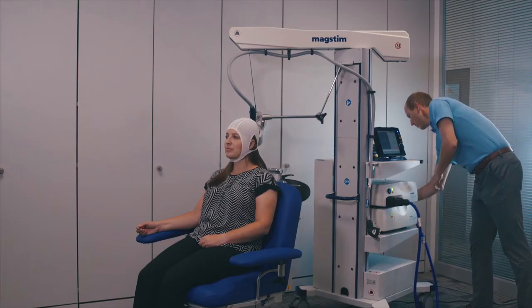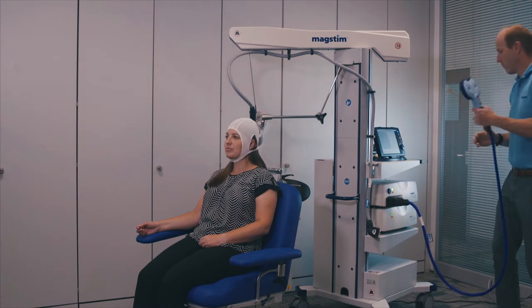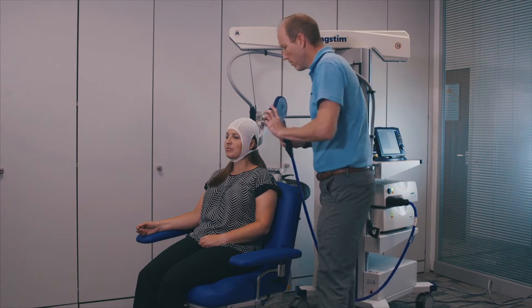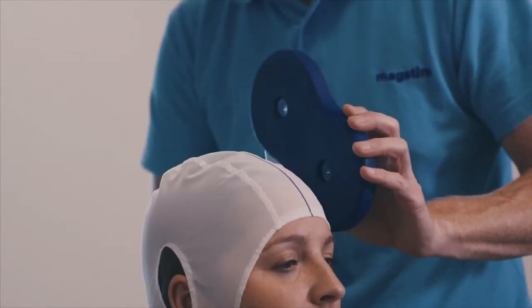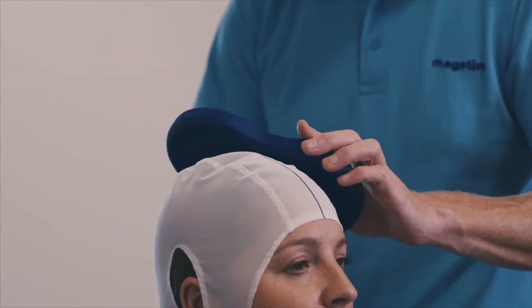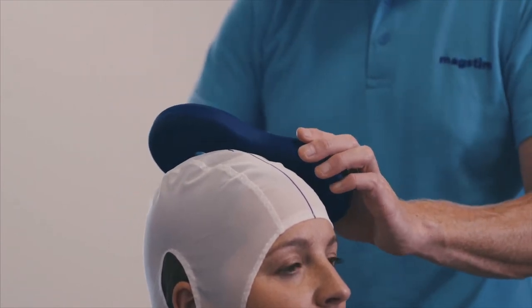Take the Horizon MT coil from the coil holder and position the coil so that the center recess sits on your C3 mark. The coil should be at a 45-degree angle to the midline marker and placed tangential to the curve of the head, with the center on C3.